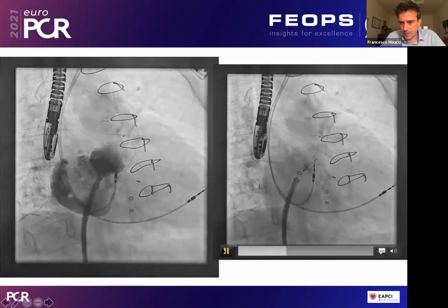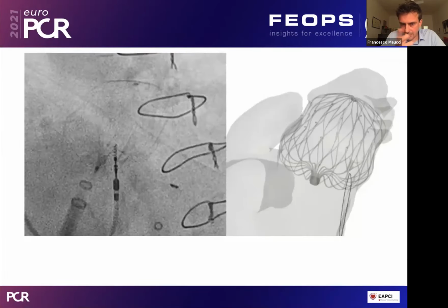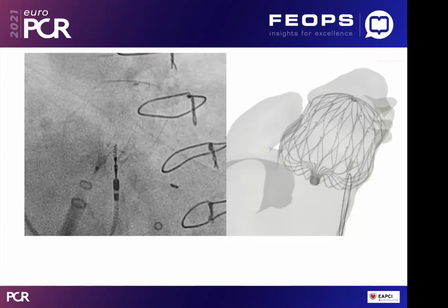This is the release of the device, and as before, the little picture of the device deformation and the prediction of FEops. And this is the last slide of my second case. So I think if you have a few questions, we have a few more minutes. Christian? Yeah, sorry, Francesco, there are no more questions for the timing. I propose that we go for the quick poll first, and then we can come to additional questions afterwards.